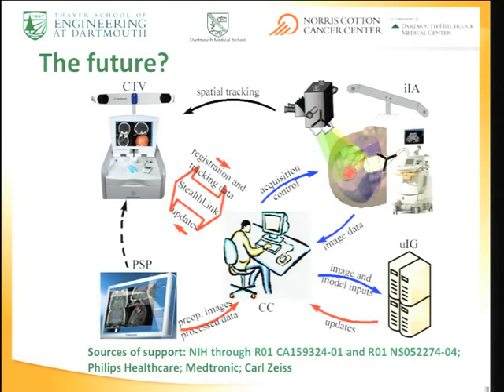So we envision this control system, if you will, probably having an operator because things aren't that automated, that would acquire these data streams at given times at the request of the surgeon. There's a fair amount of computational processing, but it's all remarkably cheap. I mean, we just bought a 32 processor, 64 gig RAM machine for about $6,000. It's amazing what you can now get. So this data is going to come in, ship it off, or have it right next to you, and then feed this back into the stealth so the surgeon can look at it.